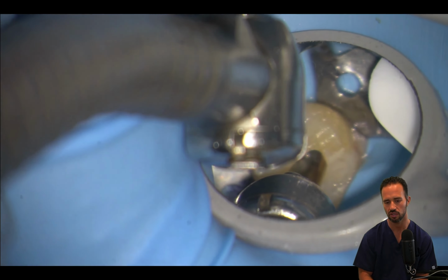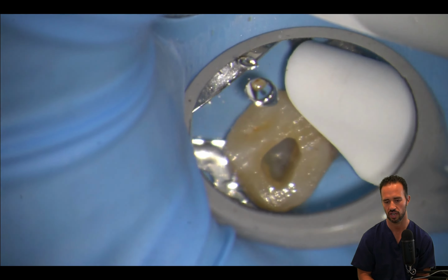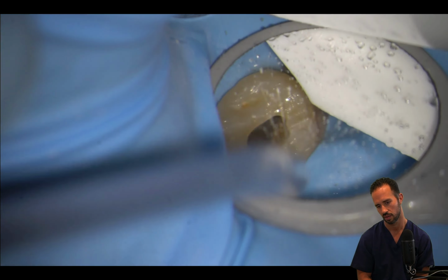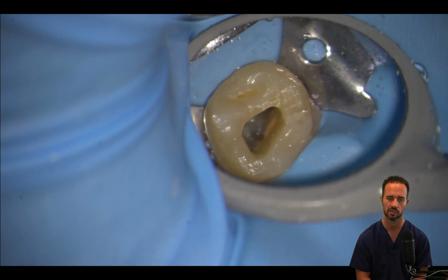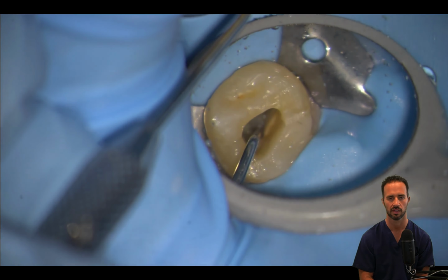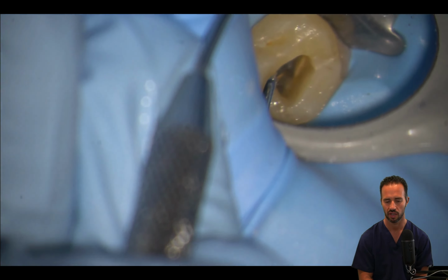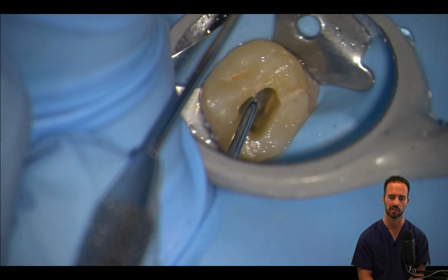So I'm going to just continue to unroof that area of where the MB2 should be, and we're going to just check one more time just to be sure. And clearly this is a little easier with a surgical operating microscope, but I do these same kinds of things with my loupes. And I'm just pushing in there into that region of where the MB2 should be, just making sure it's not covered by a little sliver of dentin.